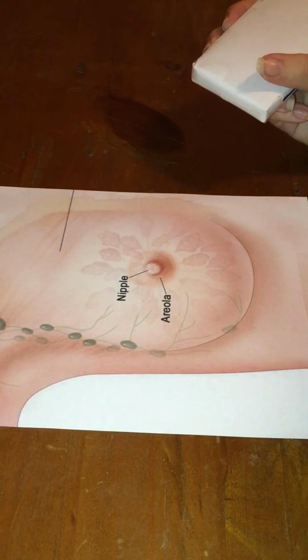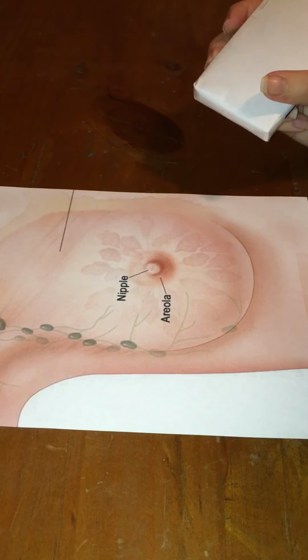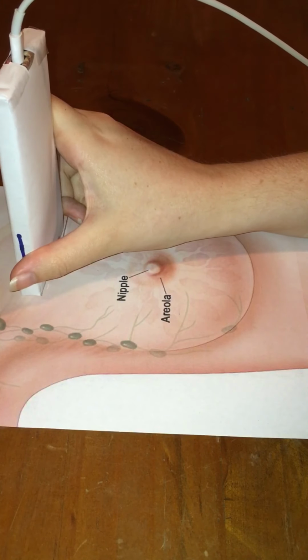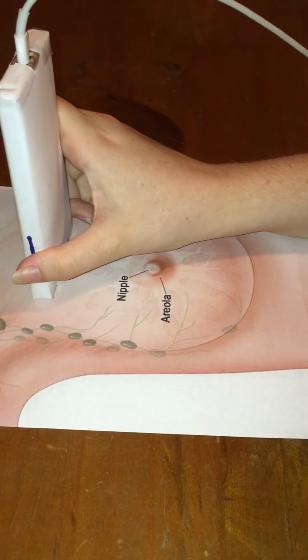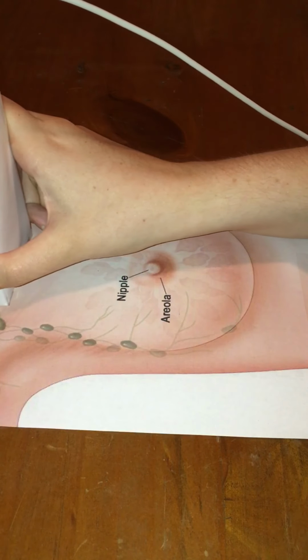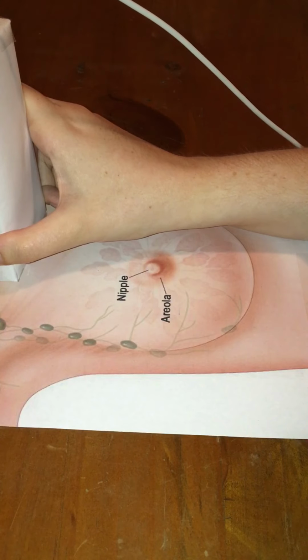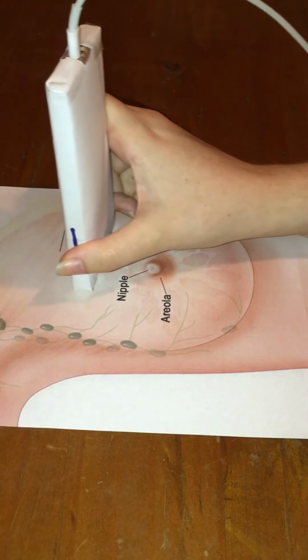I'm now moving on to the anti-radial survey of the breast. To start off with, the transducer will be in the transverse plane at 12 o'clock at the superior portion of the breast. I'll then slide inferiorly until I reach the nipple. I'll then move back superiorly to the starting point. I'll then move radially slightly until I reach about 1 o'clock and repeat this process.